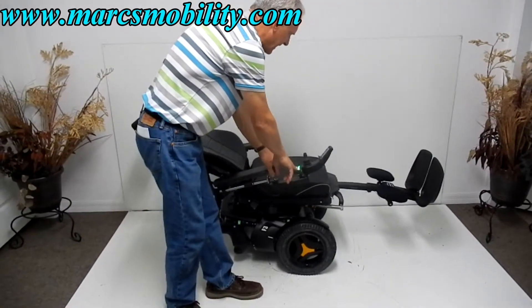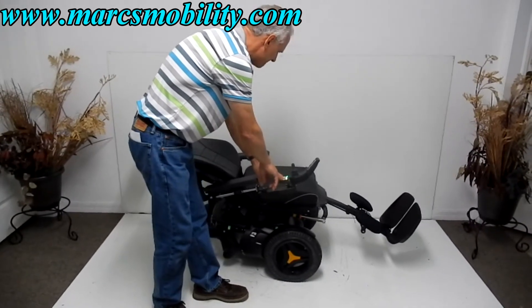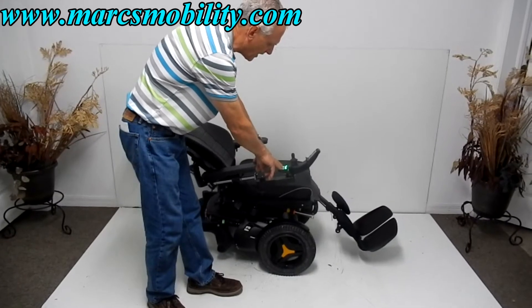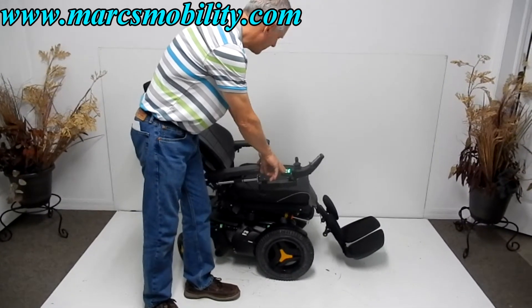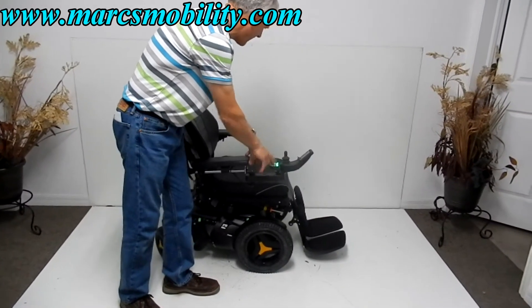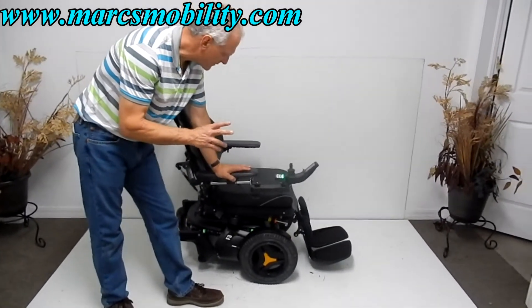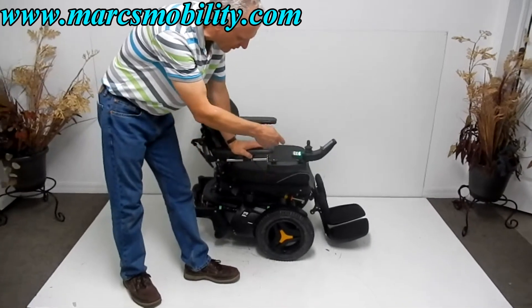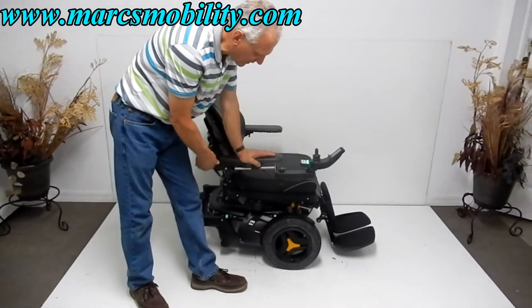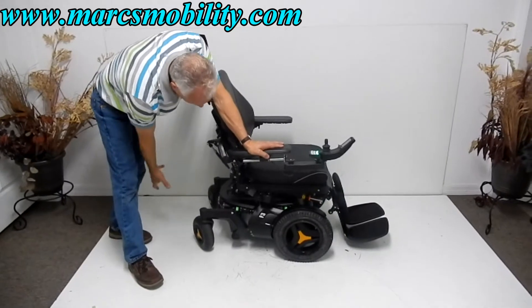Now I'm going to bring the legs back down and the back back up. This chair does have two batteries — they're a Group 34, 60-amp deep cycle battery, and it takes two batteries to run this chair. Both batteries come out from the back on a tray.